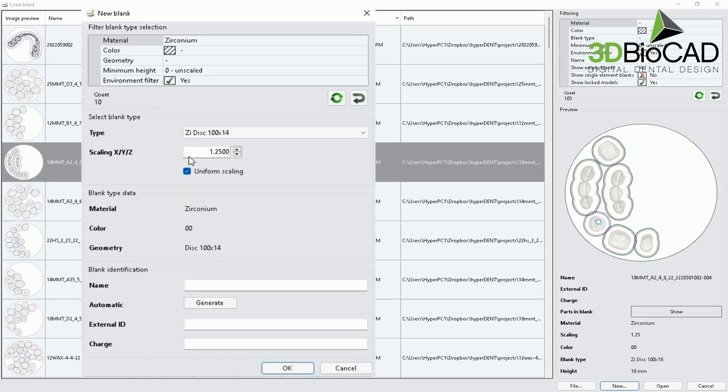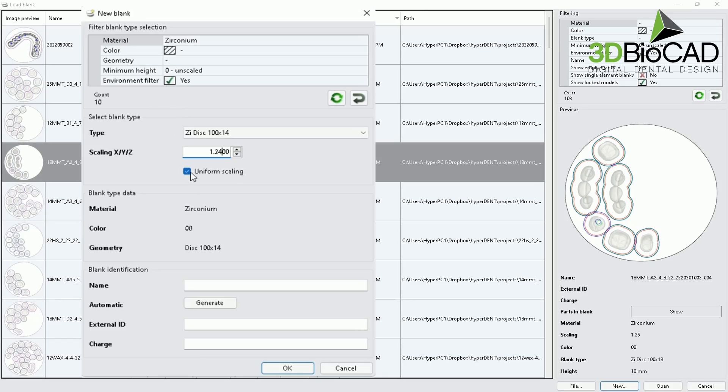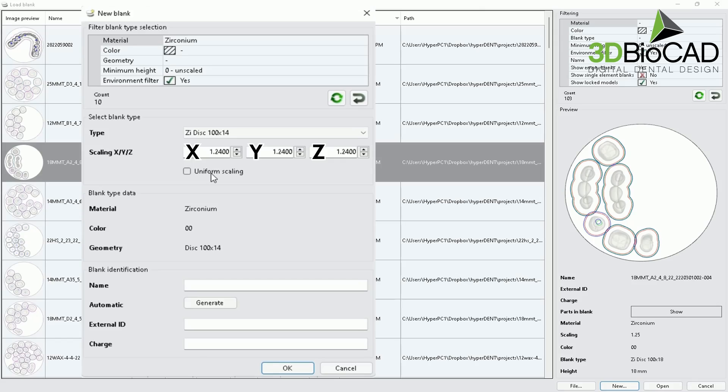And make sure you write down your scaling factor, which is a shrinkage factor. It can be 1.24 or 1.25. And also, some of the zirconium blocks have different shrinkage factor for x, y, z. So you can also write those down depending on the shrinkage given by the manufacturer. But this time, I'll select uniform scaling of 1.24.